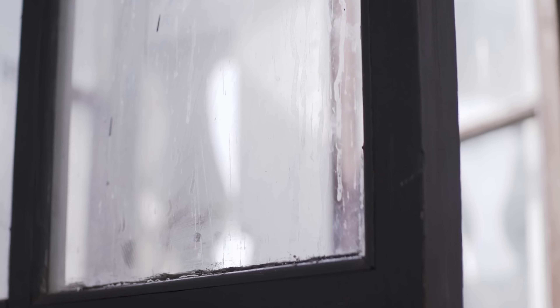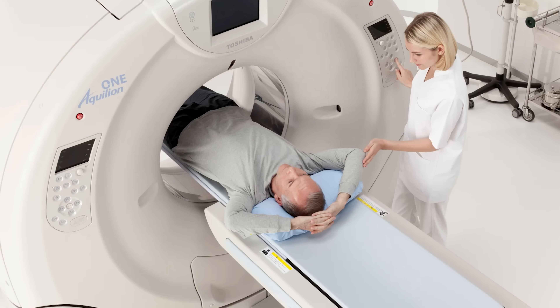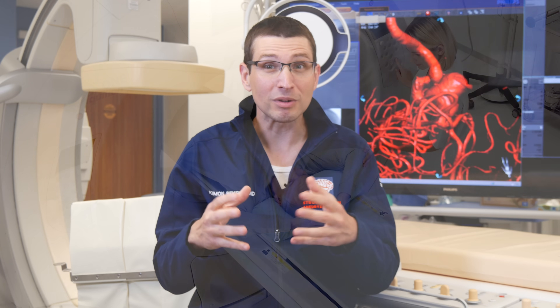Challenges of Head CT come from its inability to look at the brain at a more granular level. The common metaphor that I use is that Head CT is like looking at the brain through a fogged-up glass. Other imaging modalities allow us to unfog the glass and look at it better. Another significant benefit of Head CTs is that when a patient goes into the scanner, it's a very short test and it's through a large donut-looking machine, so claustrophobic patients generally don't have a reaction to that machine.